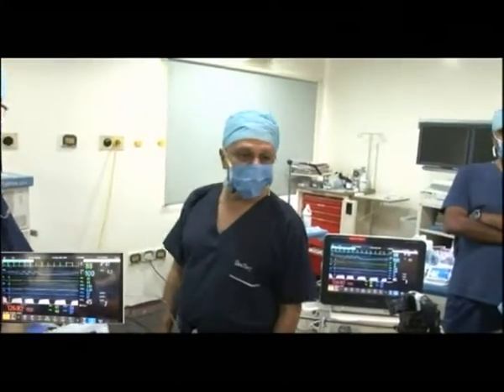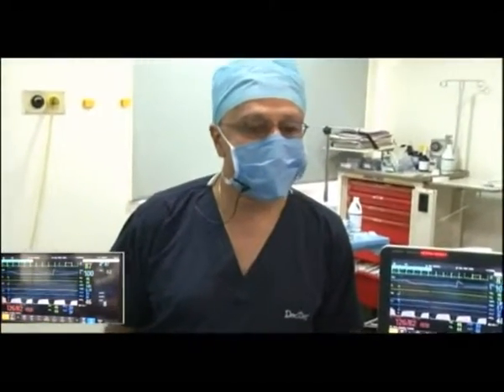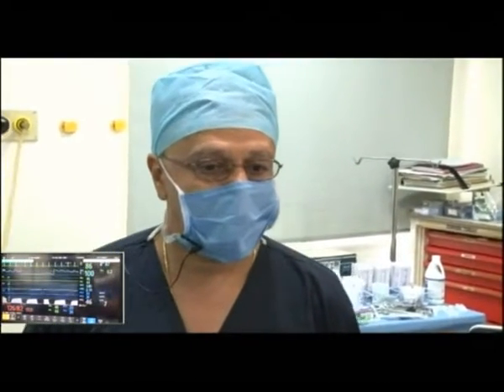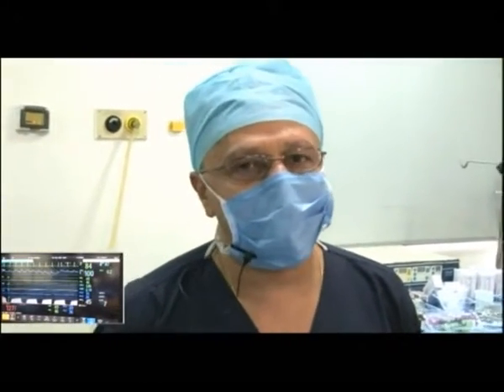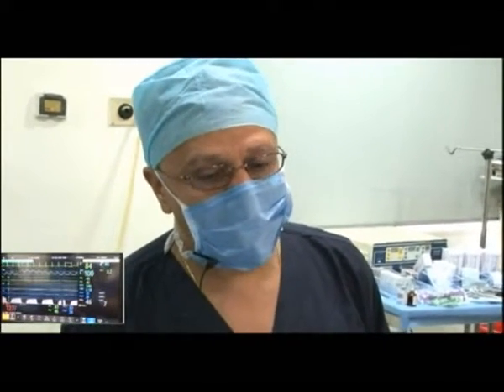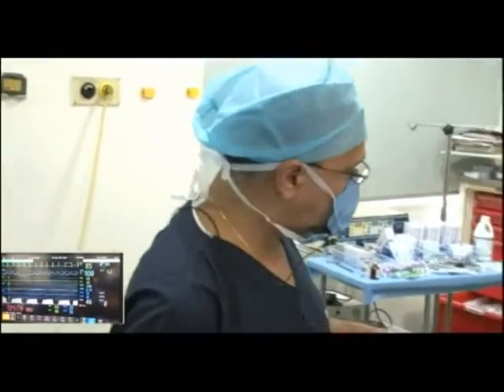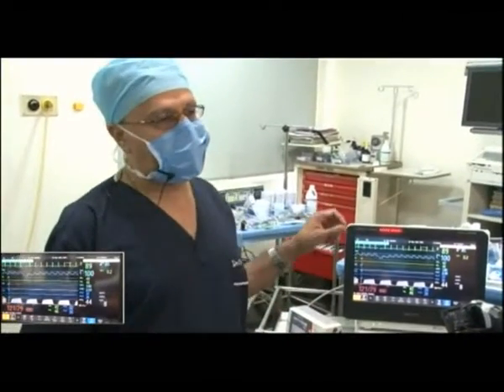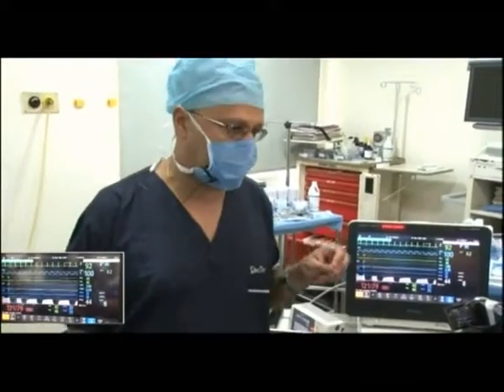Dr. Joshi, I have a question. Sure. Of course, this monitor doesn't display that. Do you use age-adjusted minimum alveolar concentration for inhaled anesthetics? I couldn't hear you, I'm sorry. What did you ask? Do you use age-adjusted MAC values? Absolutely. So the monitors, I don't know about this Philips monitor, but the monitor we have typically, when you look at the MAC value, the default is for a patient who is 40 years old.